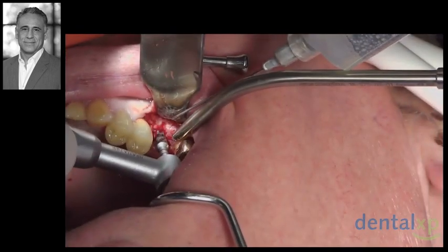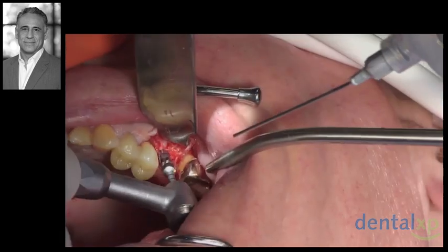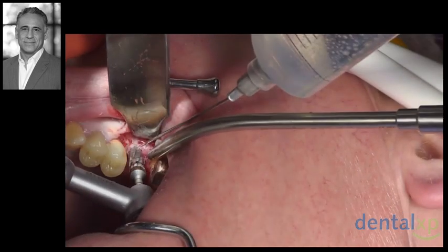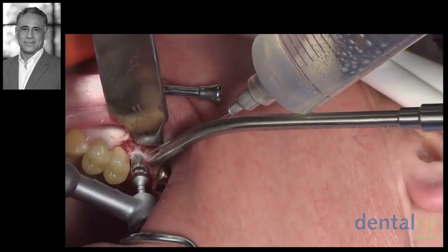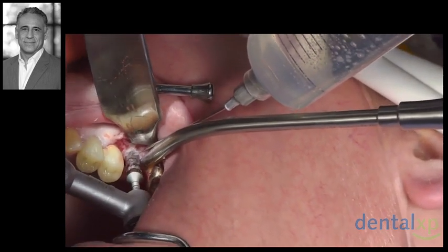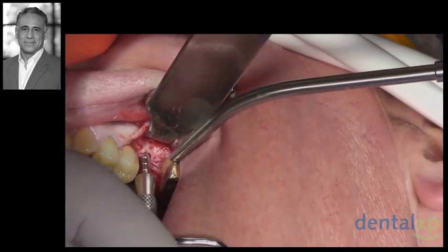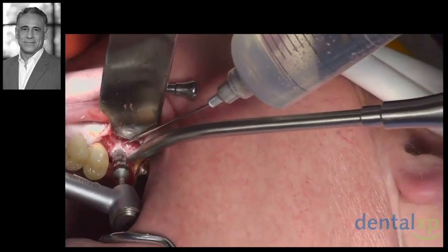We go back again to the osseodensification burr and continue the osteotomy and the densification process using wider burrs, slowly advancing it to about 12 millimeters. We'll go back and forth and keep raising the apical bone and densifying it in all directions until we have reached the right diameter and our desired height of about 12 millimeters. Using the densification burr in forward mode prepares the site, removing bone from the lateral and apical sides, and then immediately compacts it and moves it apically when it is reversed.